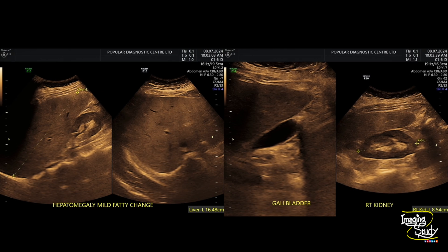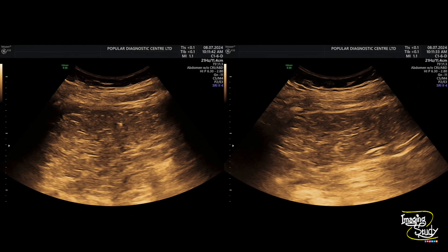Here is the picture. You can see the fatty liver with hepatomegaly. This is the gallbladder and this is the right kidney. When we come to the subhepatic region, you can see this large fatty area. The echogenicity and echotexture of this lesion is similar to the subcutaneous tissue, indicating it to be a fatty lesion.